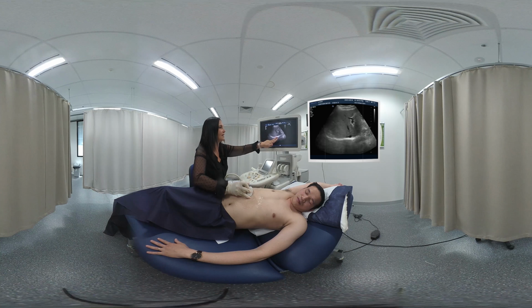So let's just have a look at the liver. So we're going from the left over to the right. Now big breath in, patient. So we're just going over to the right side, and we're in the longitudinal plane. We would just want to open up our focal zone. I might take harmonics off because we need some more penetration, and we need to optimise by using our TGC and our 2D gain. So here we're just having a look all the way through that liver.